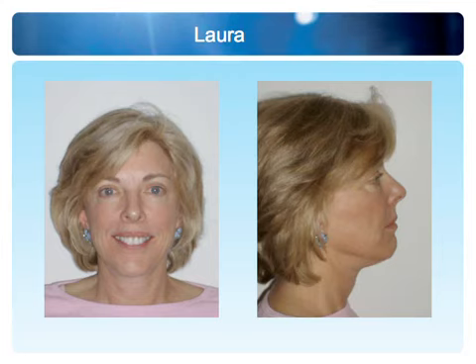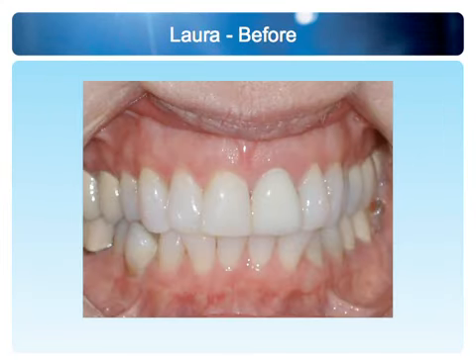And she even pulls her lip up there to hide what doesn't show there, so it's really not a natural smile to begin with. And when we look in the mouth, we can see and determine that these are average-sized teeth. I can tell you that these are 9mm centrals, so they're not big. Just because they're prominent in the smile doesn't mean that they're wide or large teeth. So the first thing I did when I saw that smile is measure to determine, well, we have an average width of tooth, so there must be something else going on here.